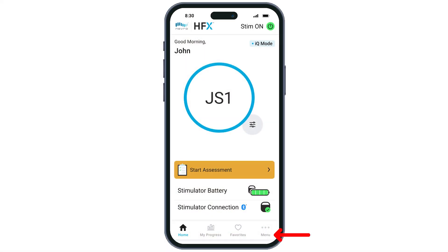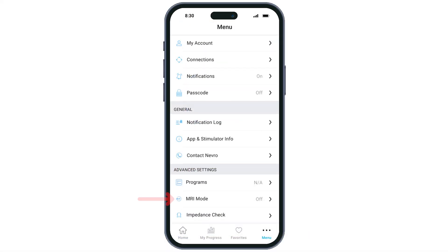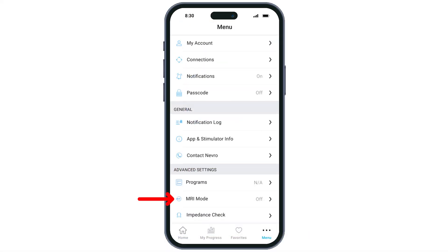The day of your MRI, you will need to place your device into MRI mode. This can be done by tapping the menu icon, then tapping MRI mode under advanced settings.